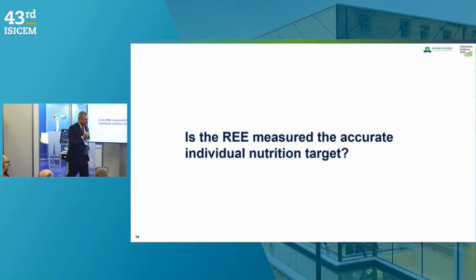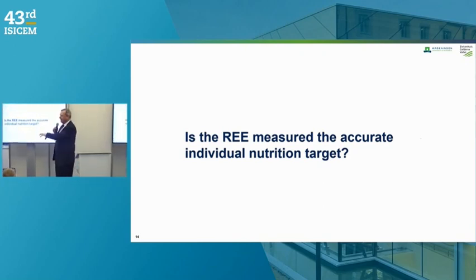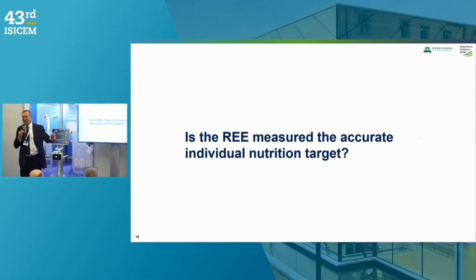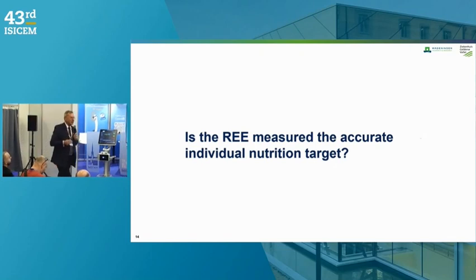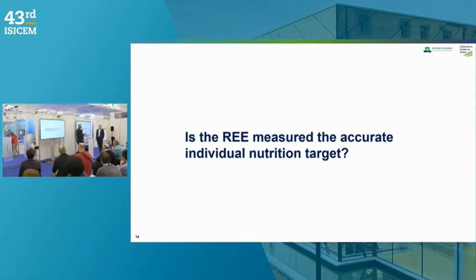Now, one of the difficult issues we want to discuss, when you have a reading of the device and it tells you 1900 kcals, should you give 1900? When do you have to give this, or more or less? Any ideas? Are there situations that you would give less calories than what the device would predict? First days or acute phase of disease? Acute phase. Horst, do you always give what you measure, or maybe in certain situations you go higher or lower?